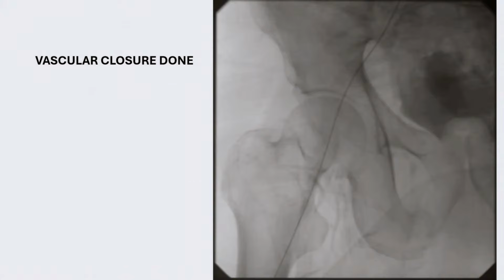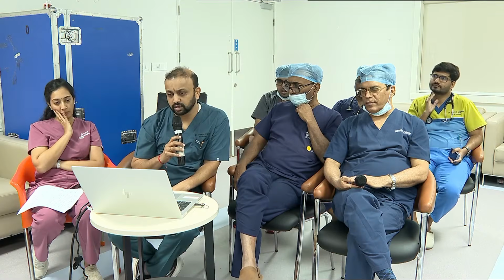We will go ahead to the next case, and we'll have some brief discussion about the important steps and what precautions we will take in such kind of cases, because it's a high risk case: a frail man who has already undergone a CABG and is 83 years old.